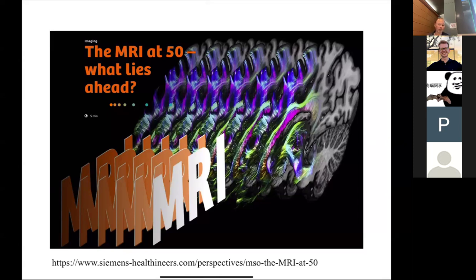Yeah, there's a couple of issues. Remember there's three different coils, right? The primary concern is always whether this thing's going to get ripped out of the body due to the main magnetic field, right? But you can design things such that there's not enough force. You can calculate the forces on it, and as long as there's not too much force, you can use titanium and non-ferromagnetic materials, like carbon fiber wires, that are not going to experience that magnetic force.